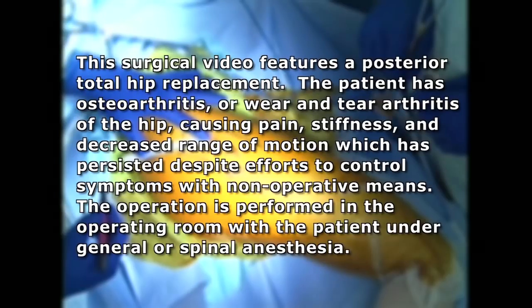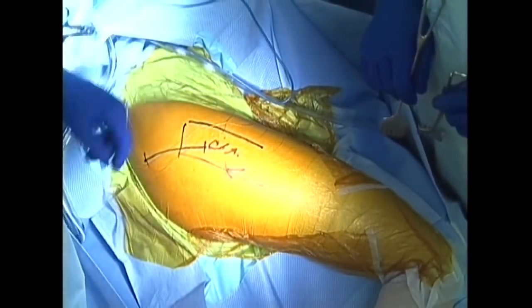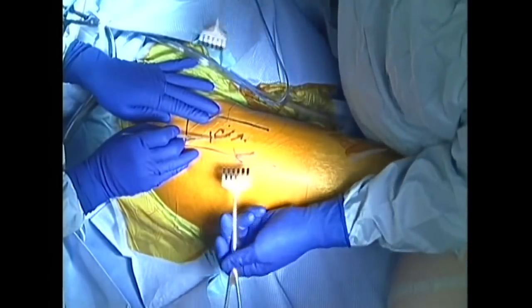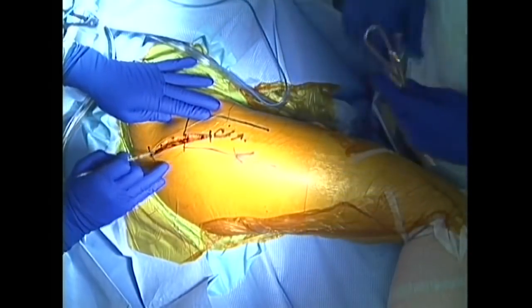The operation is performed in an operating room with the patient under general or spinal anesthesia. The incision line is drawn approximately 10 cm in length, and a skin incision is made with retractors placed to assist with deeper dissection.